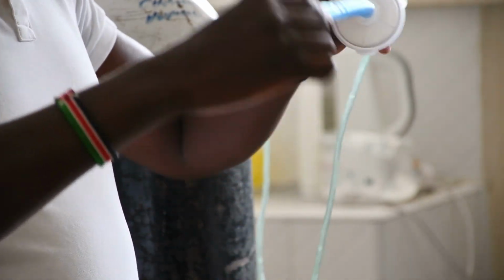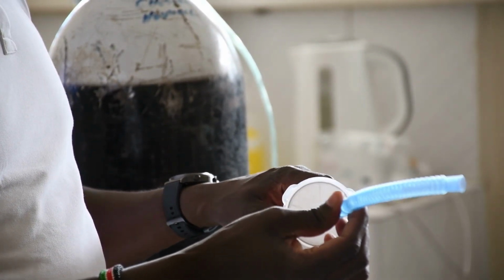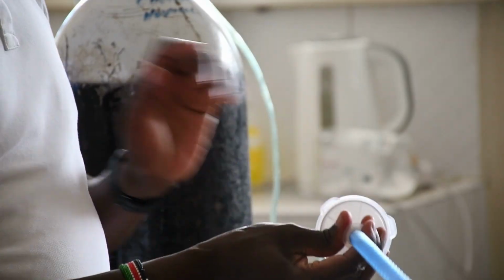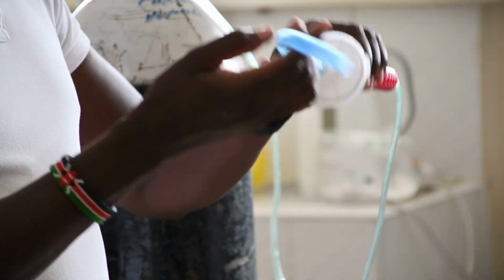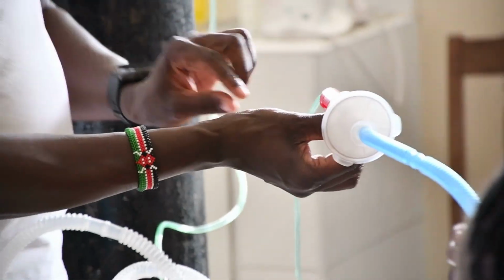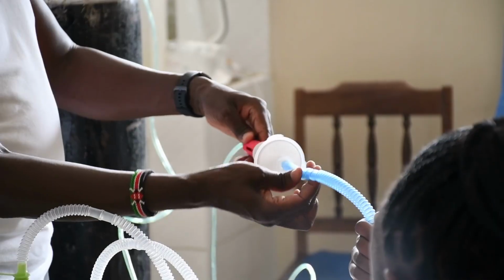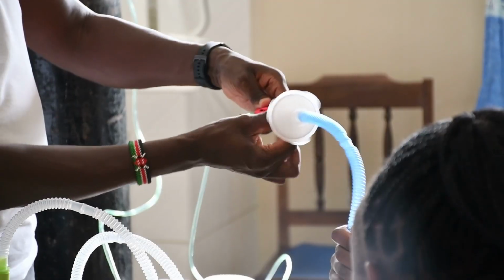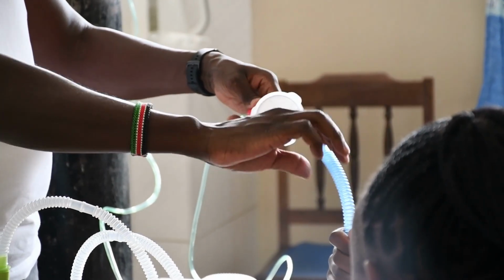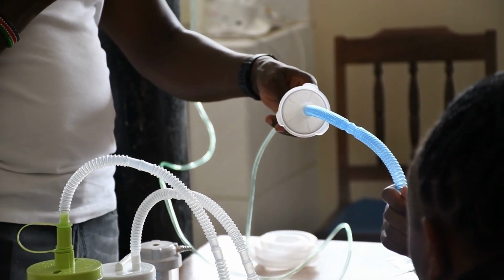So once you have this tubing here, you will always want to adjust this part without interfering with this part, okay? If this part was all held up, then you couldn't adjust this part. And now you see when you have this rotator here, let's say I want to adjust this part, then I can do it without this one also moving. So I can make my adjustments without interfering with this end of the device. Okay? That's why you need the rotator.